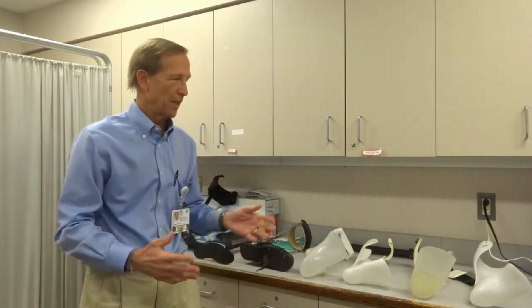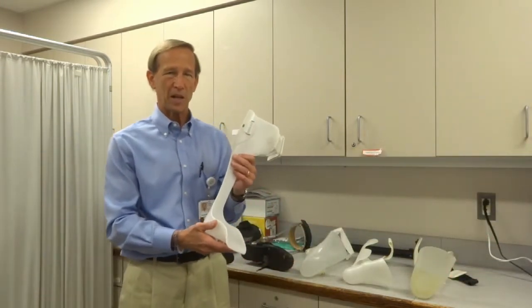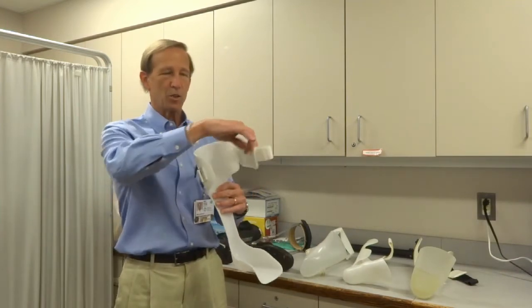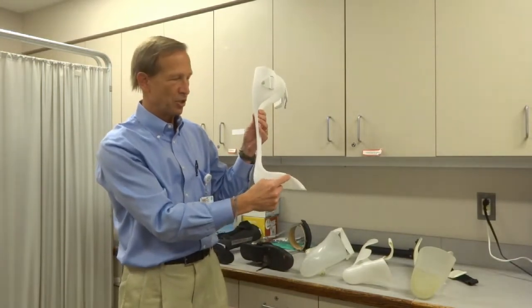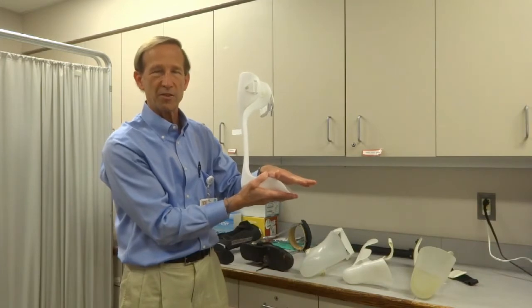Today's segment will focus just on AFOs — ankle foot orthotics — basically controlling the foot and ankle position relative to your knee and hip. The simplest type is called a custom plastic AFO. This is custom made for your leg. It goes all the way up to the calf, closes with a Velcro strap, and keeps your ankle at a 90 degree position. It's molded to the foot but allows the toes to move freely if necessary.